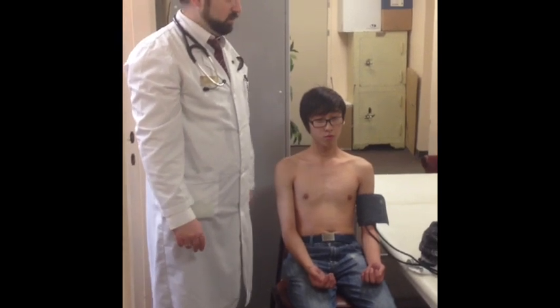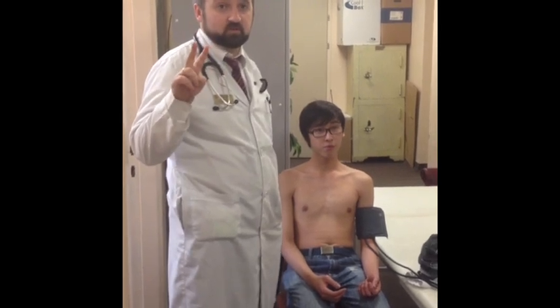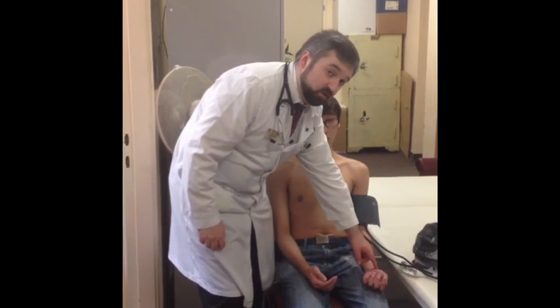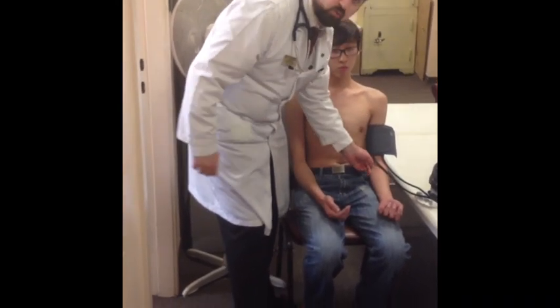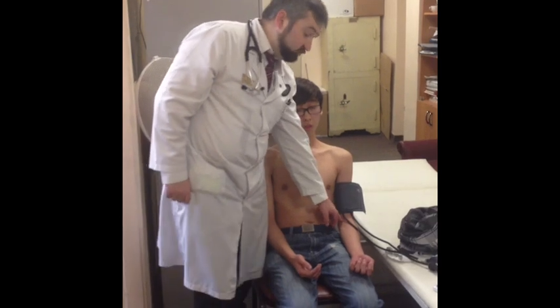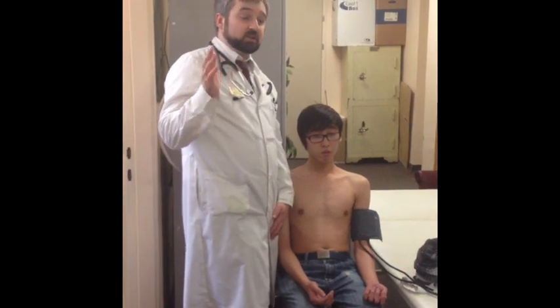According to international recommendations, the measurement must be done in two runs. In the first run, you palpate the brachial artery — it is on the medial surface of the elbow, while the radial artery is on the lateral surface. Place your fingers there and increase the pressure in the cuff until the pulse stops, then go 20 millimeters higher.